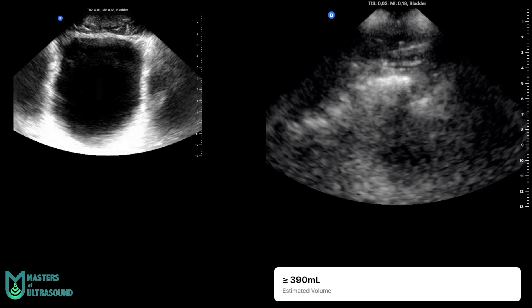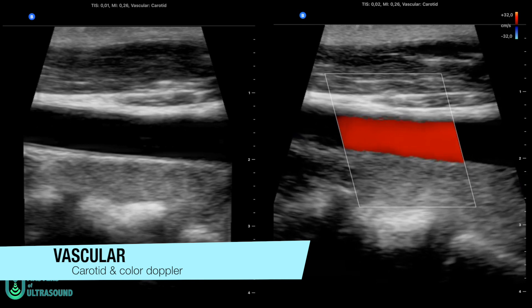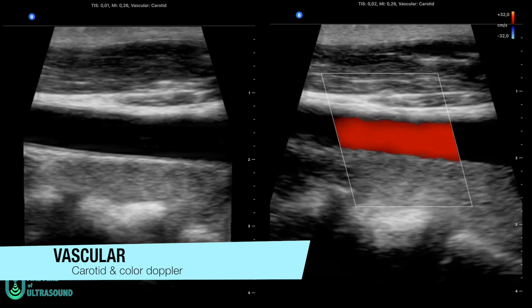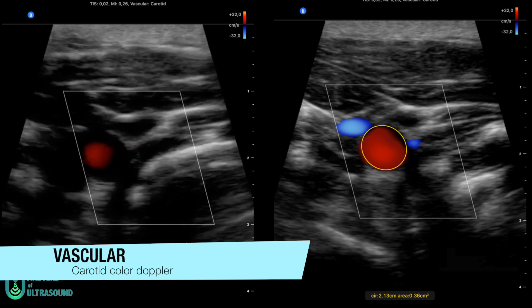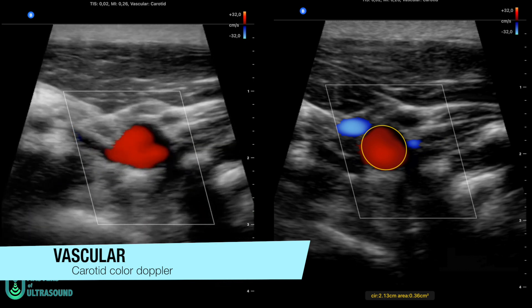Now you'll see the bladder on the left, and the images that Butterfly IQ uses to do the 3D reconstruction of the bladder on the right. Now you're seeing the carotid artery — on the left a screenshot in B mode and on the right Color Doppler. You can also see M mode on the carotid artery on the left and Pulse Wave Doppler on the right, and remember this is only available in the United States so far.